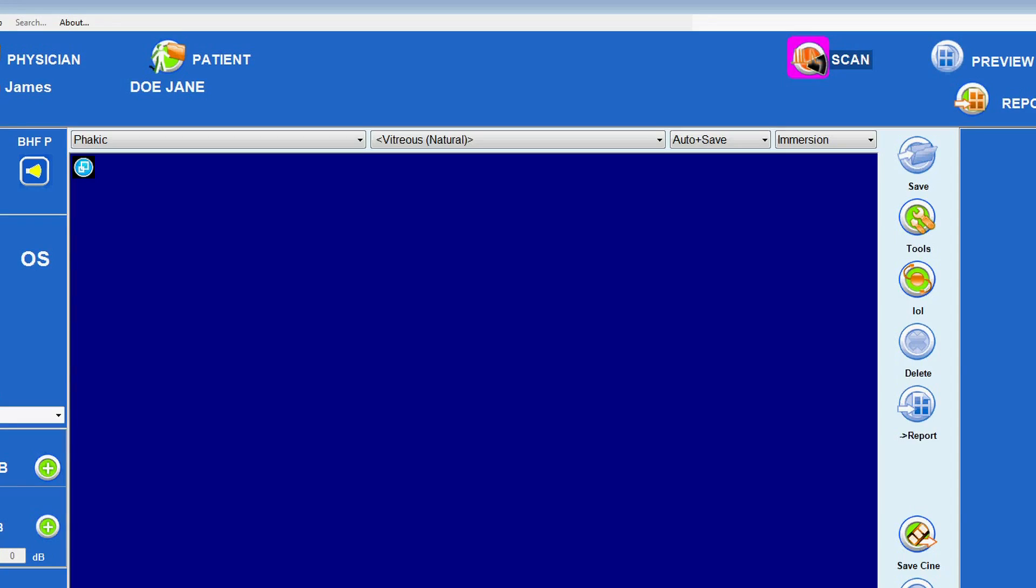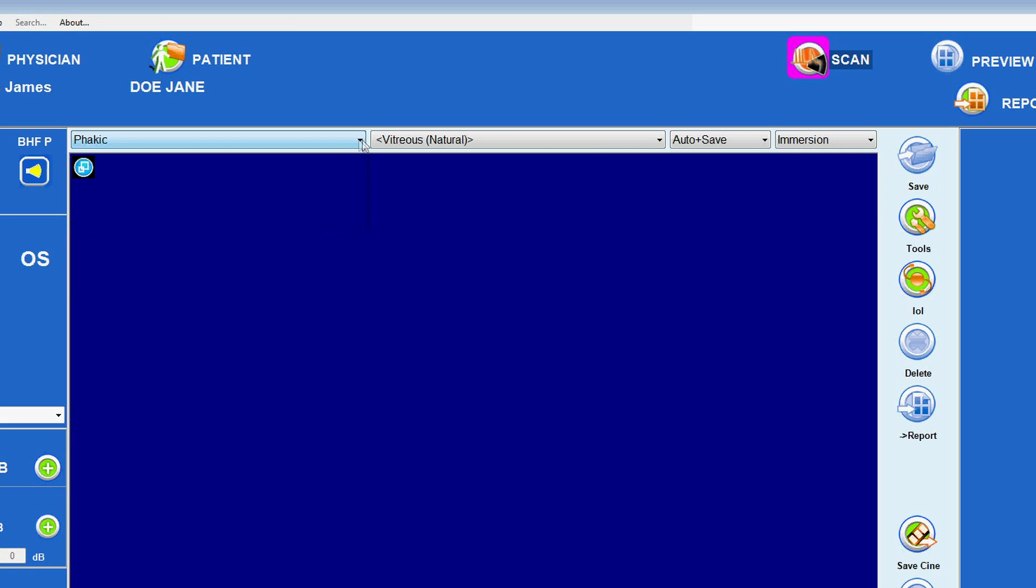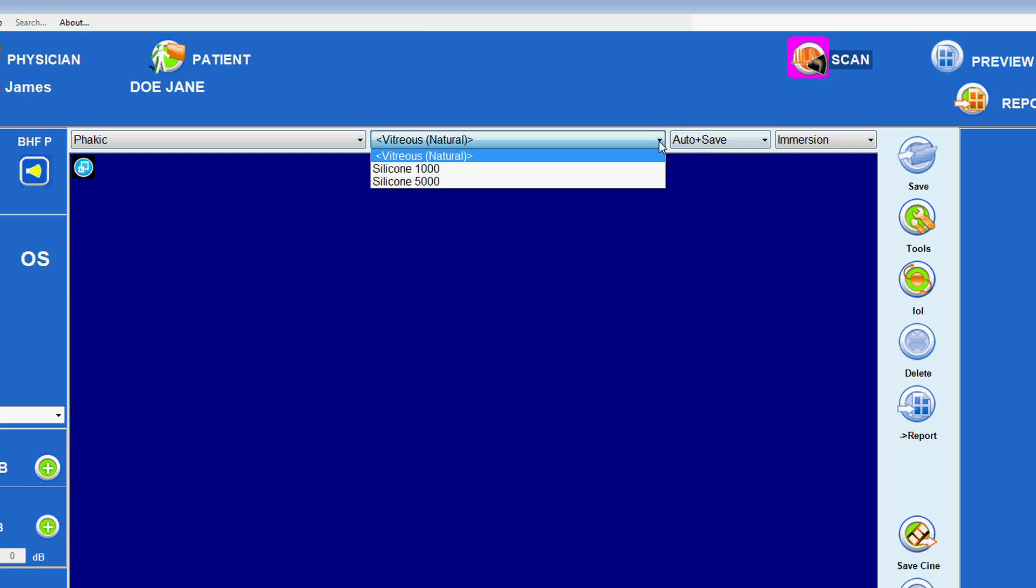The parameters of the eye can be changed by using the drop-down lists at the top of the screen. Choose the eye type, phacic, aphacic, or pseudophacic. And for those who are pseudophacic, indicate the IOL material, PMMA, acrylic, or silicone.